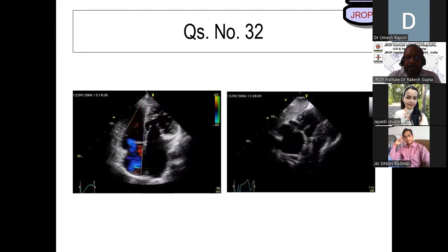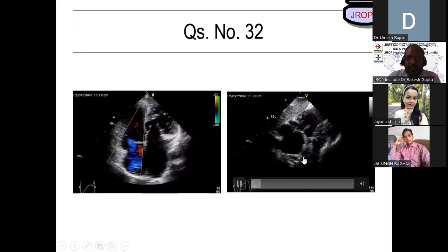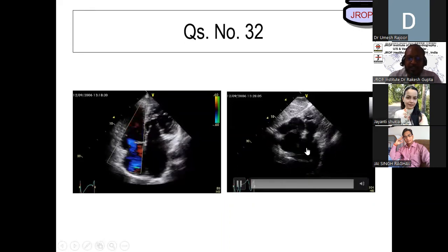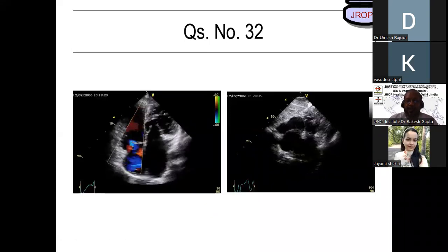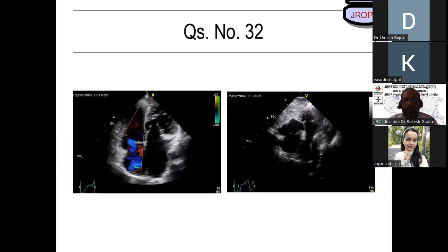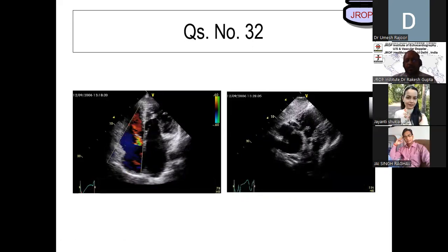So this is RA, this is LV, and this goes into a vessel which bifurcates. No, there's no bifurcation of this vessel. Sorry, this bifurcates. This is congenitally corrected transposition of great vessels along with atrioventricular discordance. RA has gone to LV, and this LV has bifurcated. The so-called aorta has bifurcated into two vessels. So they're able to maintain their relationships.